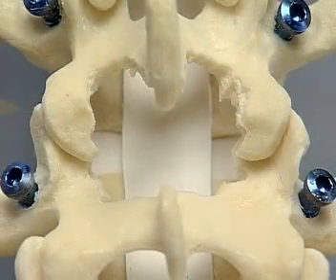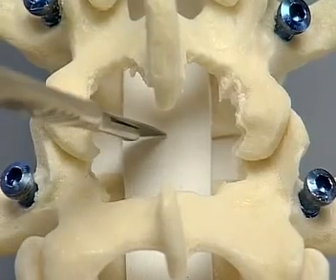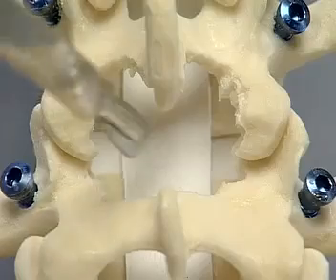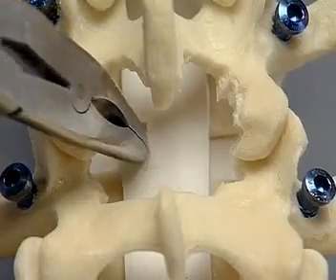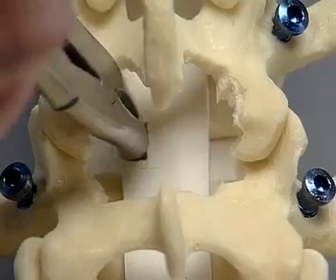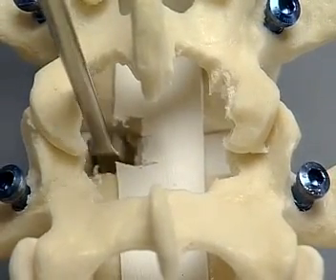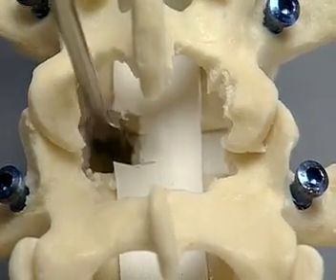The nerve root is retracted medially and the posterior annulus is opened using a sharp scalpel, cutting away from the nerve root. A pituitary Rongeur is used to remove the disc. The anterior annulus is preserved. In a clinical situation, the end plates are then prepared with the square-ended curette. It's important not to remove the end plate, but to remove the cartilage to ensure that the end plate is clean and bleeding.